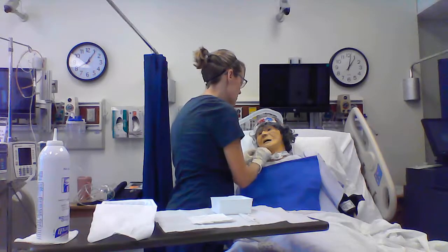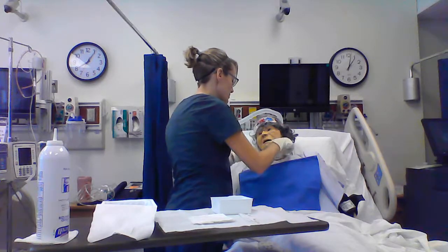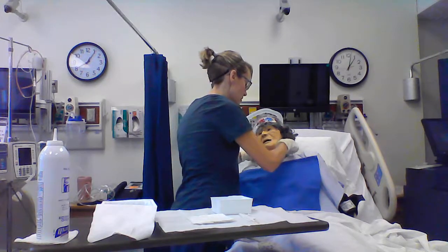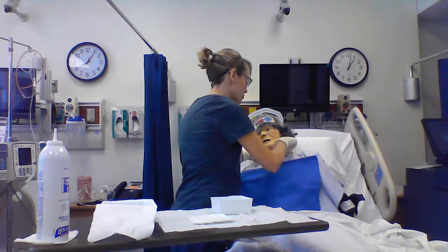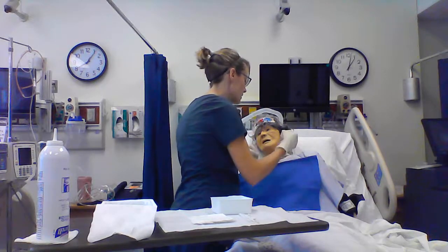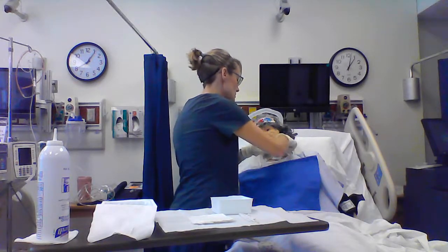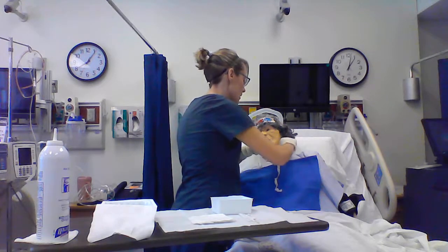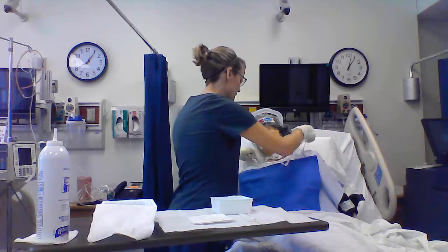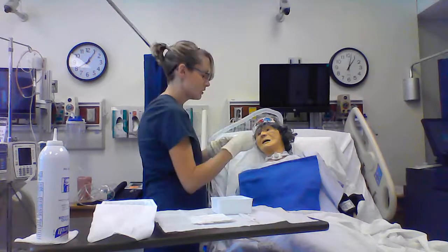So if at any time during this procedure she needs a break or she needs to be reoxygenated, you can put her oxygen mask back on her and give her a break if she needs. You just need to don new sterile gloves if you do that. You contaminate your gloves. She did great though.